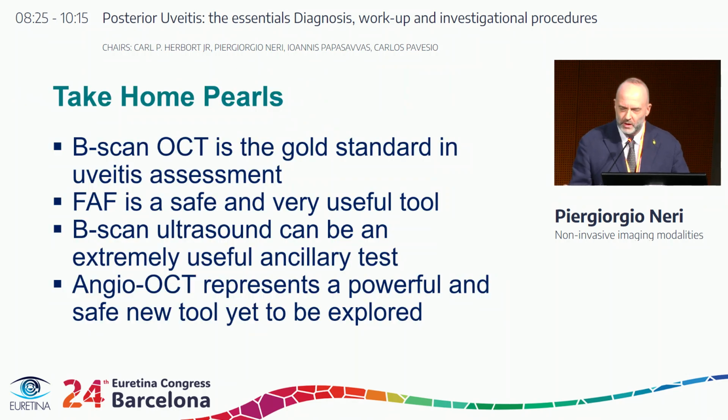Now, what are the take-home points? B-scan OCT is the gold standard in uveitis assessment, no matter what. I mean, it's absolutely important to understand that this technique is becoming probably the gold standard for the regular analysis for the posterior pole exploration.